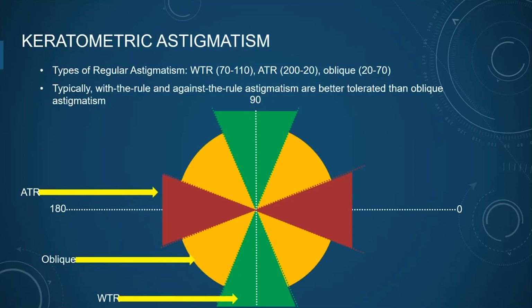And why is this important? Because most of us now, especially in modern cataract surgery, sit temporally and make our incisions over here for the left eye and over here for the right eye. There's still a number of good surgeons that still sit superiorly, and there's nothing wrong with that. But that helps us understand that if we have astigmatism in a certain meridian and we're operating 90 degrees away, even though we're using smaller and smaller blades now compared to the days of 3 millimeter and 3.5 millimeter wounds, most people are using around 2 or 2.2 millimeter wounds, the astigmatism we're creating with our incision, and conversely, the amount of astigmatism we're able to correct with the incision, is very minimal.